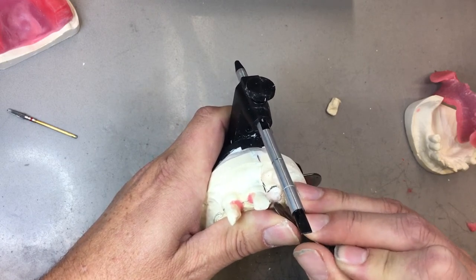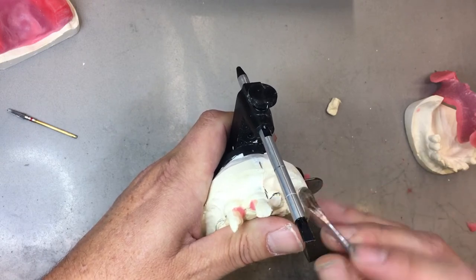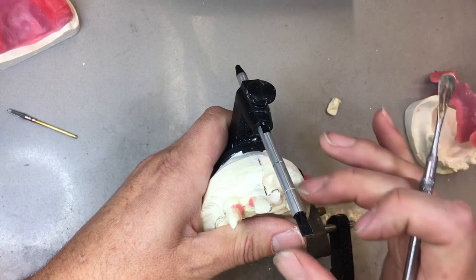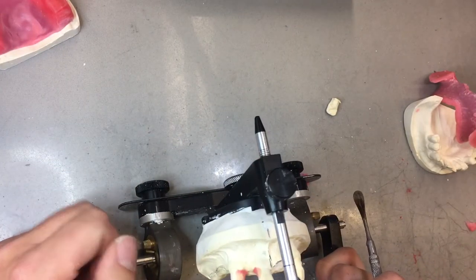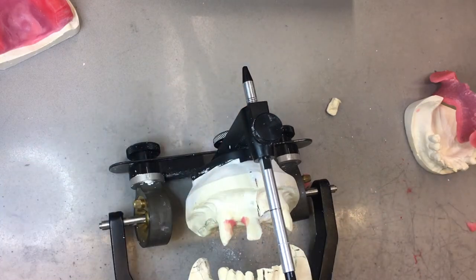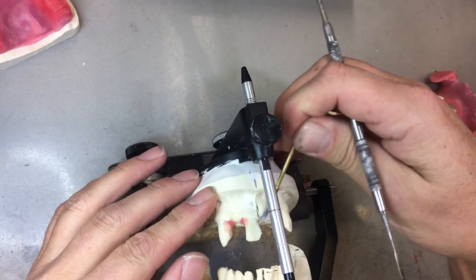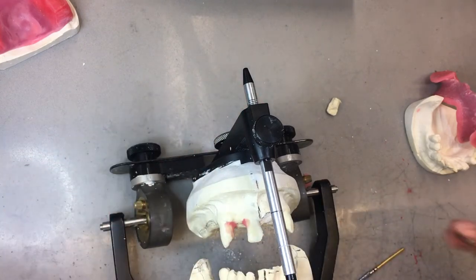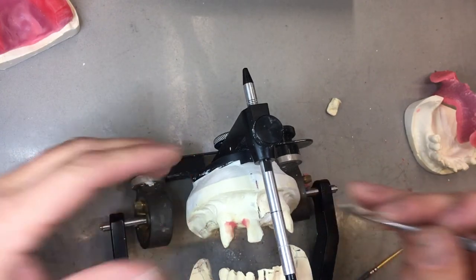I am reducing a little bit in the alveolus here, trying to create a slight concavity. I have the pencil mark of where the gingival margin was. We really have to revisit some surgical techniques — they're not just extracting the teeth out. An oral surgeon will recontour the bone. They will take out their surgical carbide and remodel the alveolar bone. Because in between each of the natural teeth is the interceptal bone. If you think of it like chicken bone cartilage — these are usually snapped off or trimmed off.